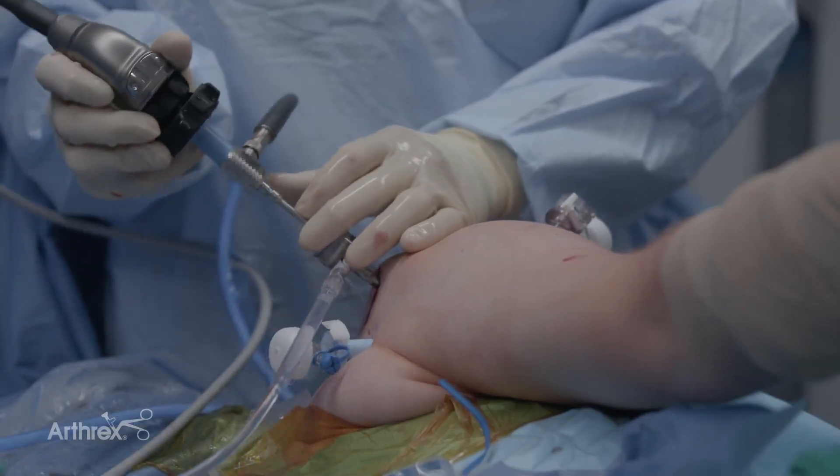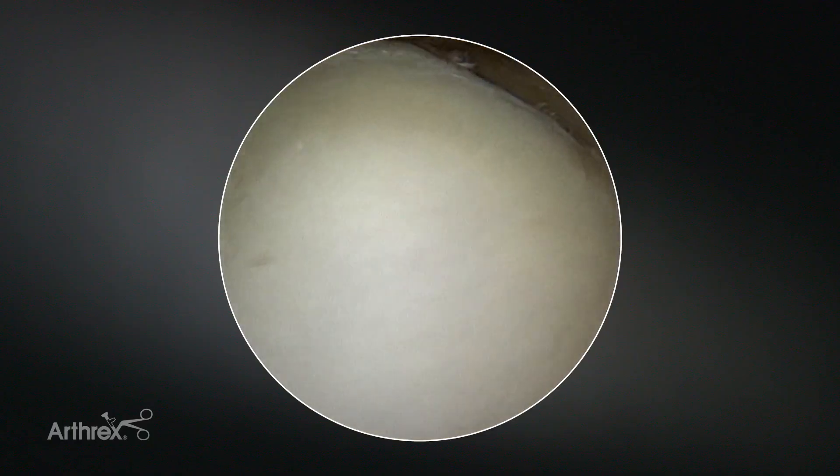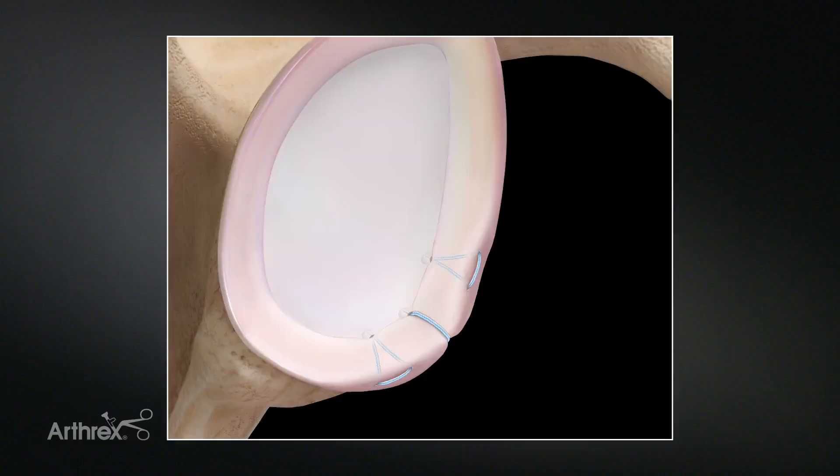At this point I'll move on to do my Bankart repair, so I need to prep the labrum first. Typically I'll place anywhere from three to four anchors from inferior to superior. You can use a variety of suture configurations with these anchors — simple configurations or mattress configurations. I often use a hybrid approach where I will place a mattress suture configuration inferiorly, a simple configuration in the middle, and then mattress again up top.